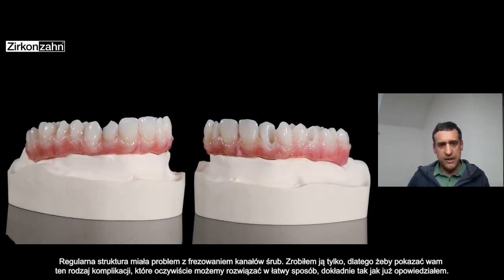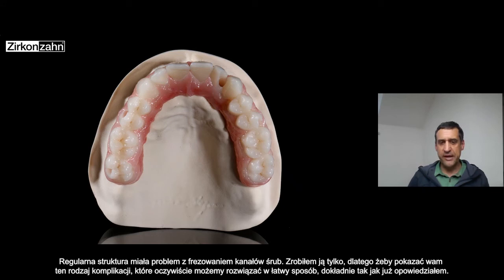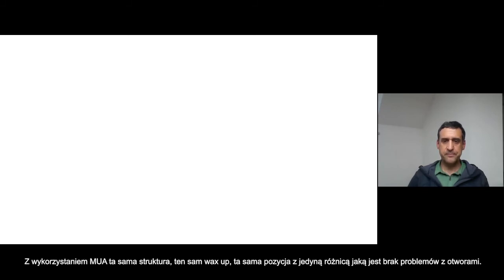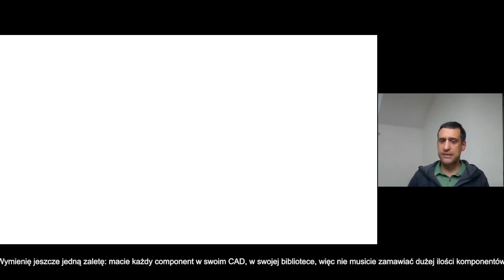Then the frameworks — you can see that the one milled straight has the problem of the channel screw. That was just to show you that we have this kind of problem which we can solve in the way I explained today. Also from the occlusal surface, you can see the channel screws are coming out in a not easy position. Then with a multi-unit abutment, the same framework, the same wax-up, the same position — it was able to manage and have no problem.